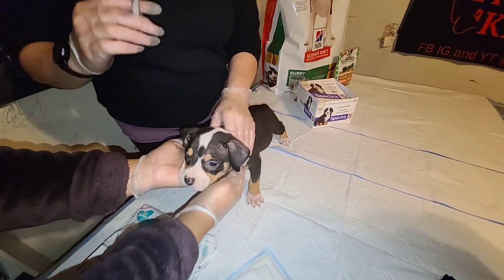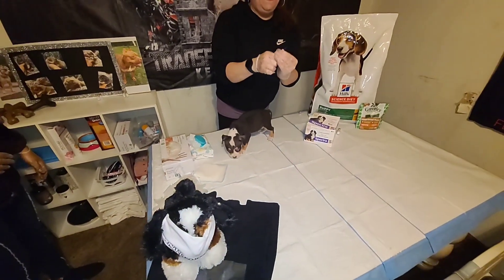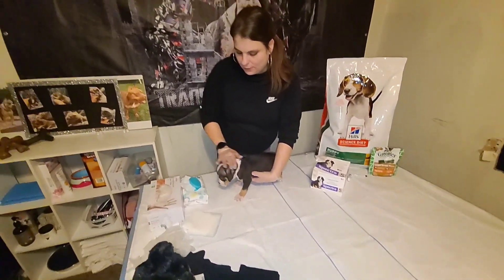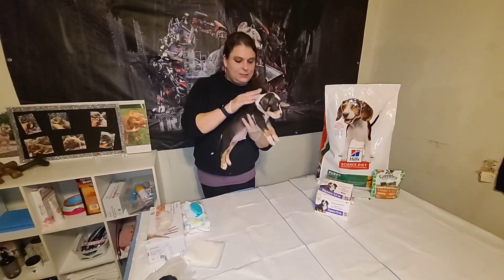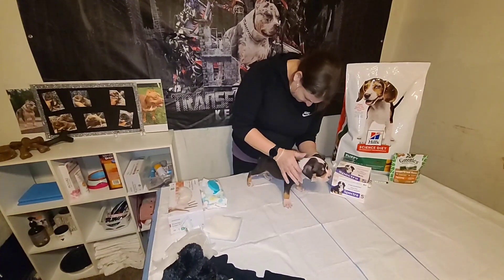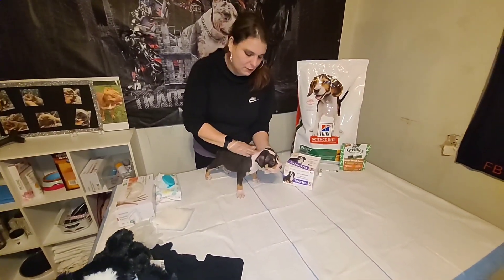He did a really good job — that's why we want to have some treats on deck. Dispose of your needle and set the garbage aside, and you're done. We're going to watch them for about 15 minutes for any signs of adverse effects from the vaccine, swelling or otherwise. Also massage their neck for a second to help absorb.